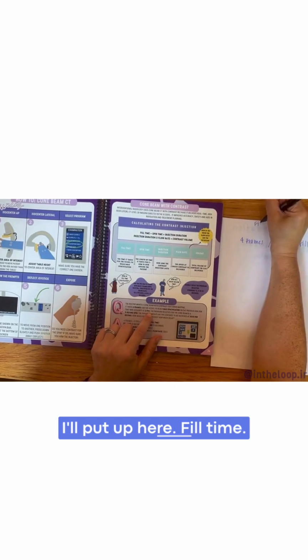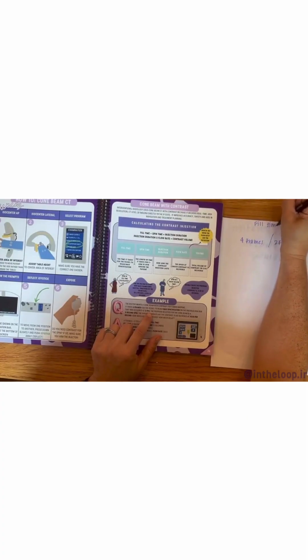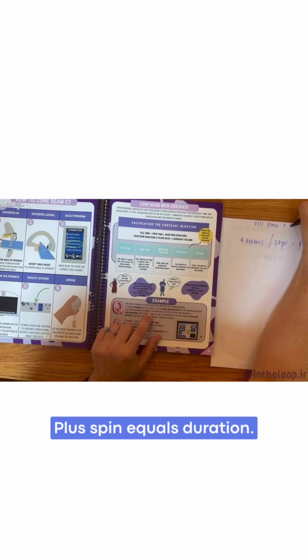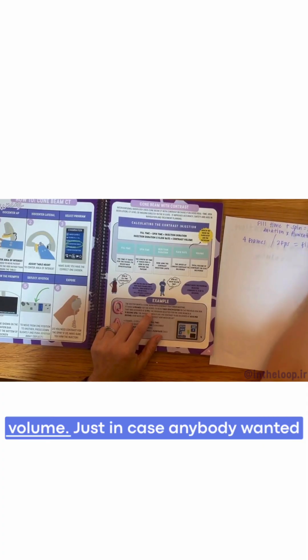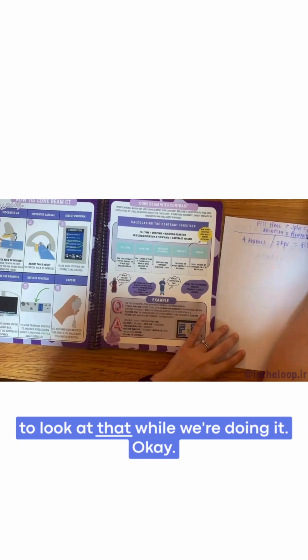I'll put up here: fill time plus spin equals duration, times flow rate is volume. Just in case anybody wanted to look at that while we're doing it.